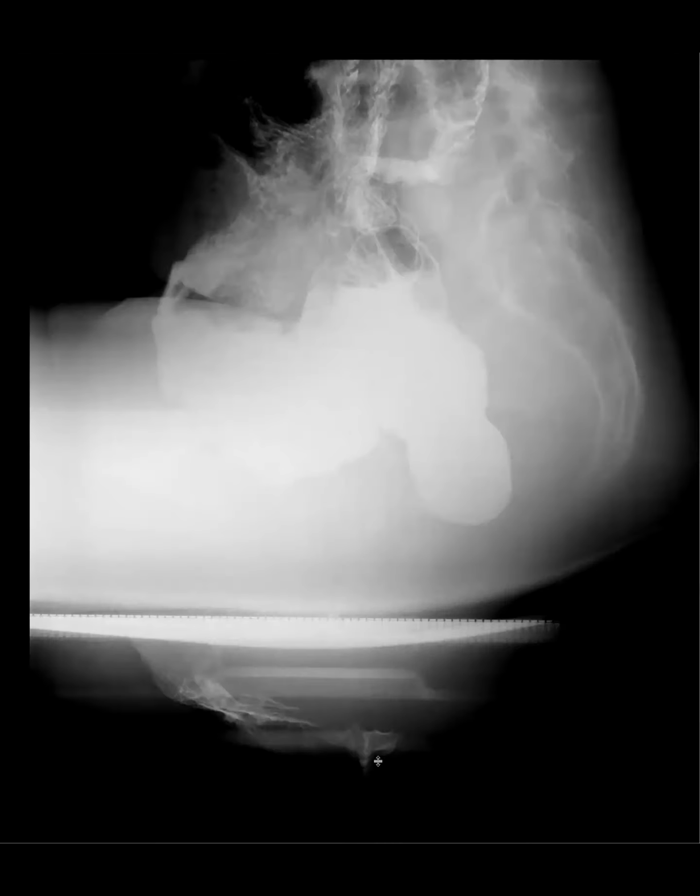And so when we got a defecogram, and this is when she Valsalvas, you can see this right there, that herniates out. So you can see that visually when you do an exam. So she does have a recurrent rectocele right there. This is what we see on imaging that corresponds to the visual rectocele that she had on exam.